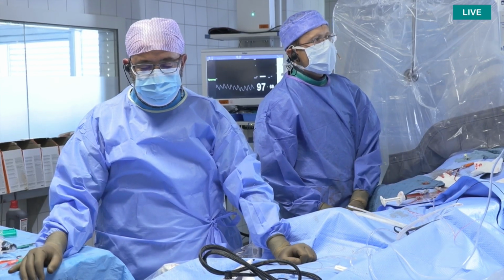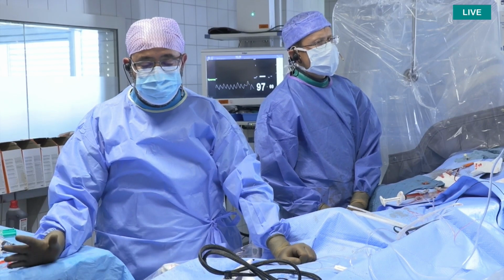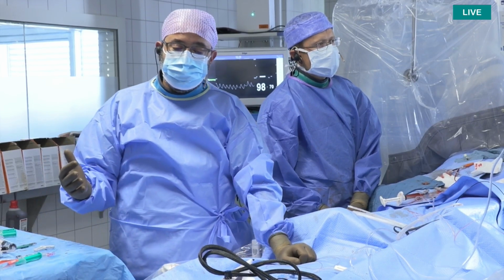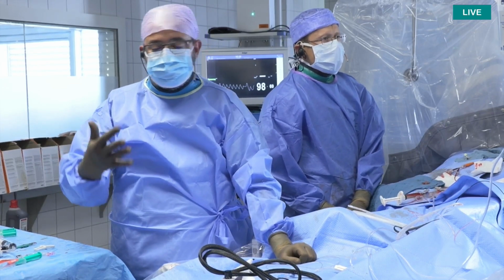These are much smaller vessels compared to the valves, and because of the blooming artifact, it's very difficult to quantify calcium in a way that helps you make a decision on how to prepare the lesion. So you will know this will be calcified.